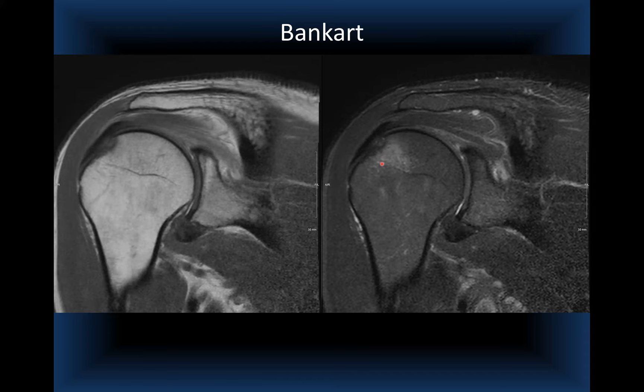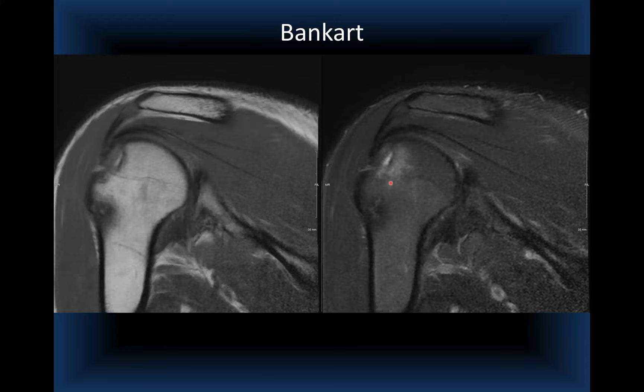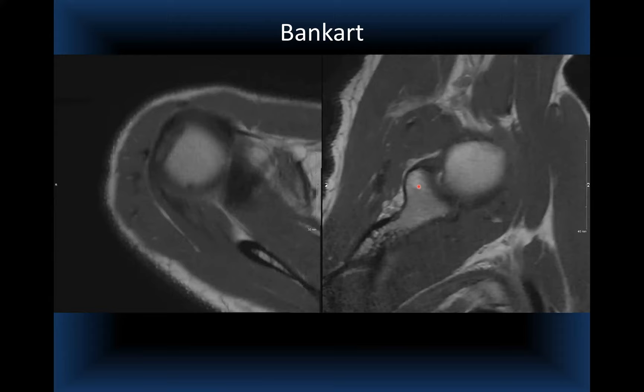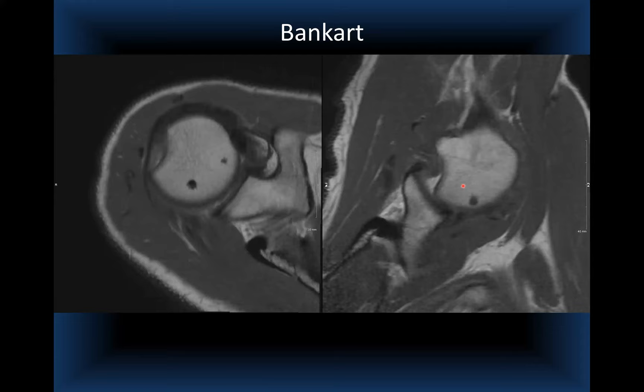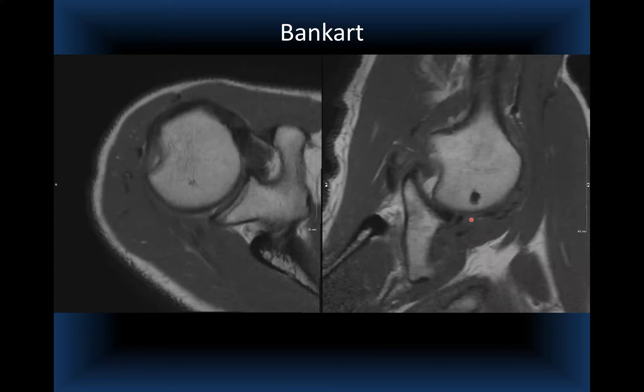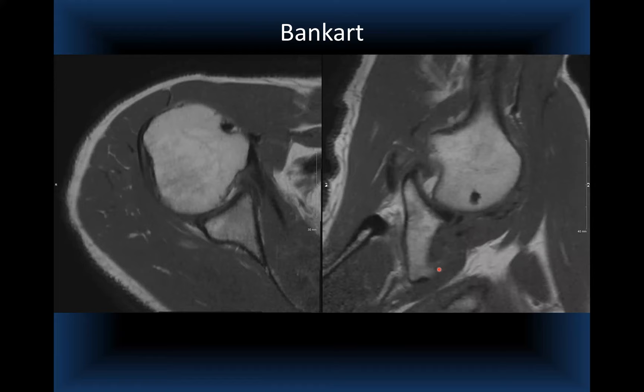Because I was watching the images being acquired, I called the technologist and requested an additional ABER sequence. On ABER, you can see how closely the Hill-Sachs lesion approaches the anterior glenoid — engagement — and the detached labrum and stripped periosteum are visible. This case was diagnosed on both routine orthogonal planes and the provocative ABER sequence, and subsequent CT confirmed a completely detached sleeve of periosteum.